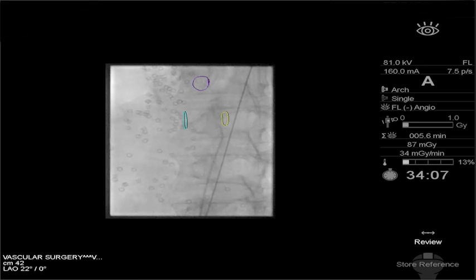Accurate endograft sizing is only the first step to ensuring treatment success. The endograft must be properly oriented and deployed, which requires accurate imaging of the patient's anatomy during the procedure. Intraoperative imaging is most commonly done with fluoroscopy. The disadvantage to this approach is that some procedures can take several hours, which increases the amount of radiation exposure and contrast used.